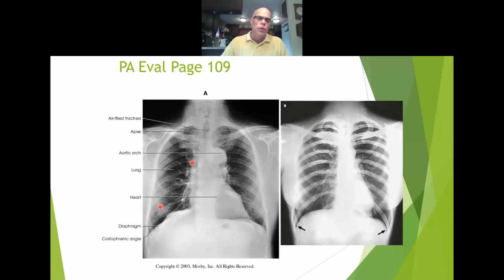The bronchial trees, everybody see the lung markings, the bronchial trees, all the little white vessels. That's what we're looking at, the vascular markings in the lung field. They call it the bronchial tree is shown from an oblique angle. The esophagus is well shown when it is filled with barium sulfate. Of course, we don't have any barium sulfate on this image. Evidence of proper collimation, presence of a marker. I'm not seeing a marker. I see a marker on this one.